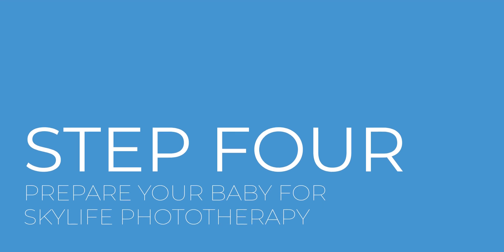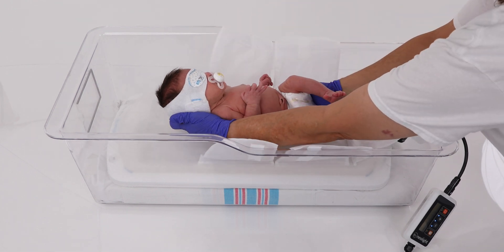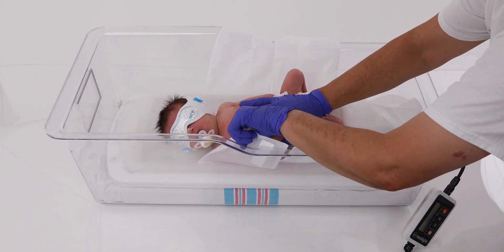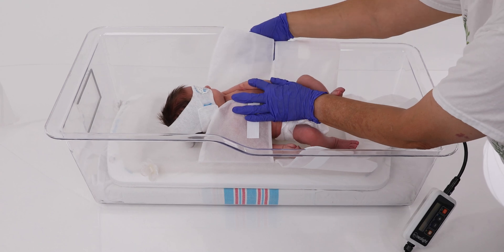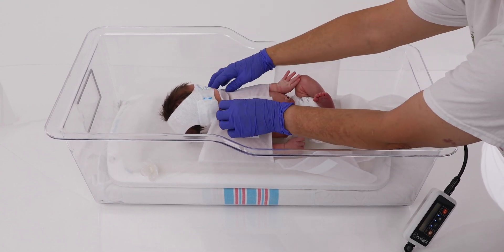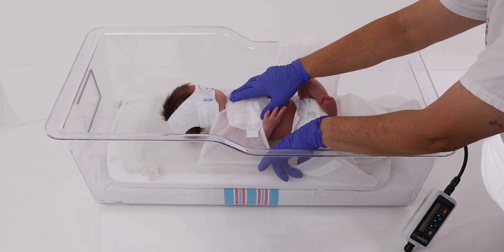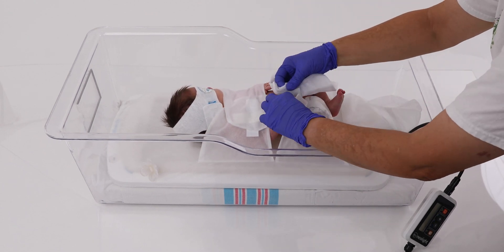Step 4: We will now show you how to prepare your baby for phototherapy treatment. Before starting treatment, always shield your baby's eyes with a protective eye mask designed for use during phototherapy. You may remove the eye protection when you are caring for the baby outside of the phototherapy area. Your baby should only be wearing a diaper during phototherapy treatment, as the light must shine directly on the baby's skin.